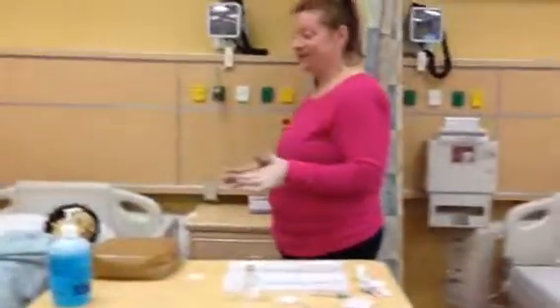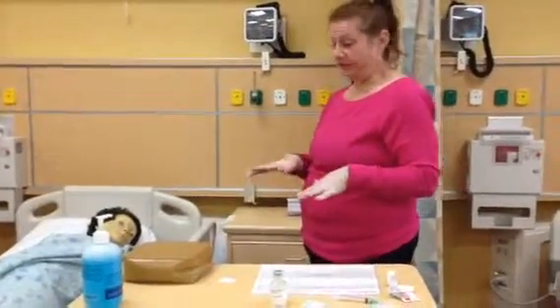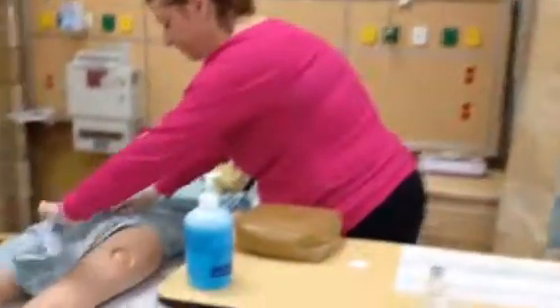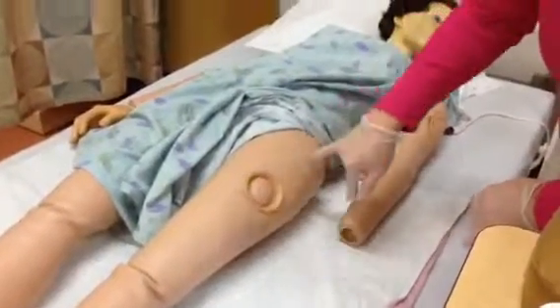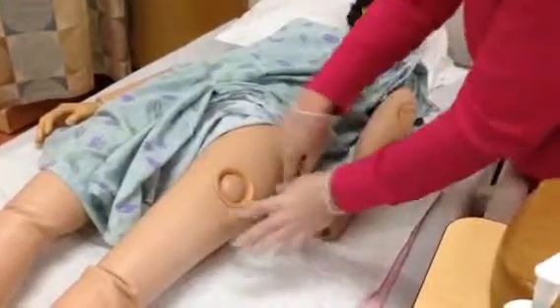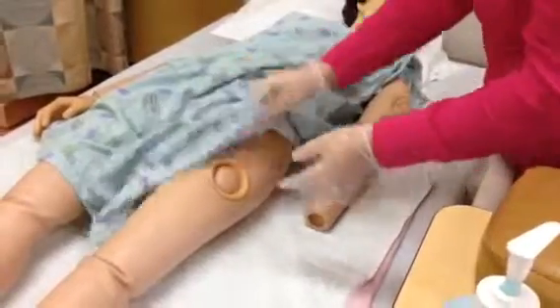So the other options I had for administering this medication would be to use the vastus lateralis site, which would be on the thigh, where I would divide the thigh into 9 sections. I would use the vastus lateralis down here in the middle of the outer section. I would also Z-track and inject there.